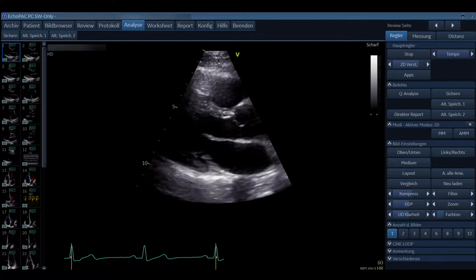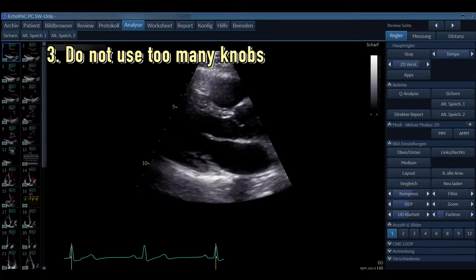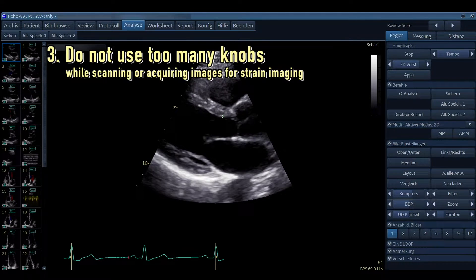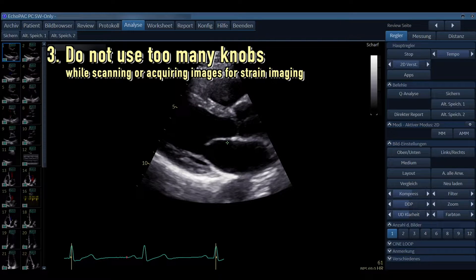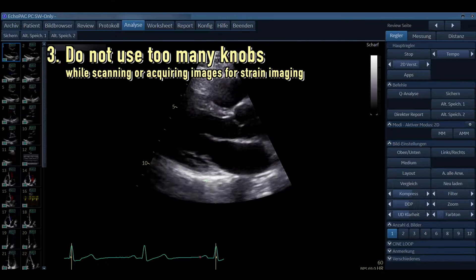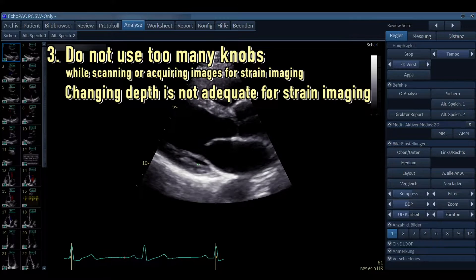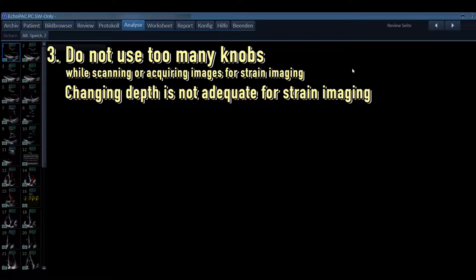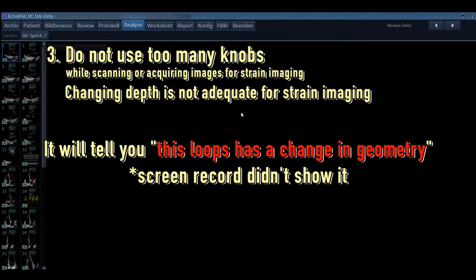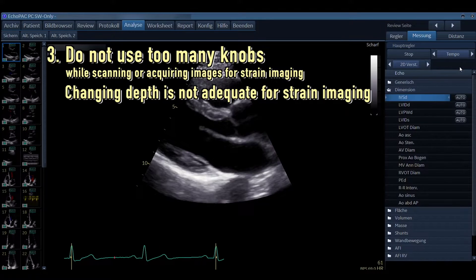You always have to check that the heart rate is approximately the same. Something else that is very important is that we do not use too many knobs while scanning or acquiring images for strain imaging. This is a parasternal long axis view, so we won't use it for strain imaging, but you can see the depth was changed. If you do that, you cannot use this view for strain imaging — it will tell you that this loop has a change in geometry: the frequency, depth, or width have been changed.